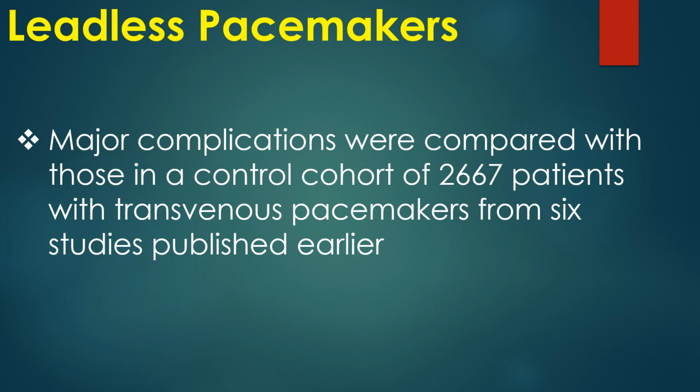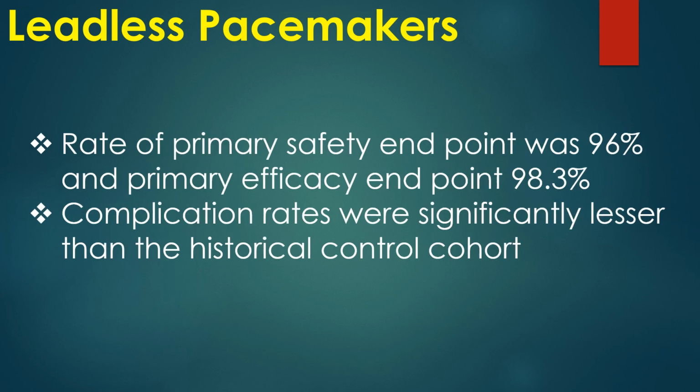Major complications were compared with those in a control cohort of 2,667 patients with transvenous pacemakers from 6 studies published earlier. Rate of primary safety endpoint was 96% and primary efficacy endpoint 98.3%. Complication rates were significantly lesser than the historical control cohort.